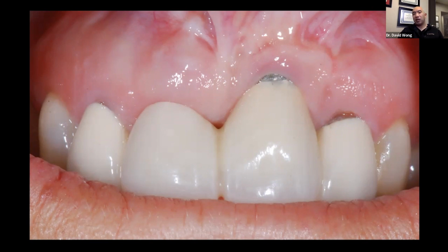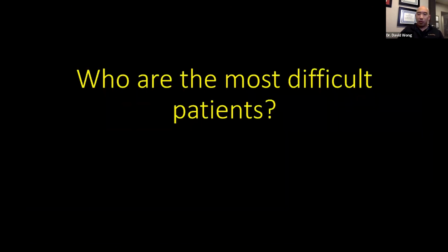I always tell people, it's not like doing a root canal where if you perforate the root, you've got to take the tooth out, or you're done. In a situation like this, if you put your implant in the wrong place and you can't redirect it, you can just choose to leave it out and start over and live to fight another day. So that's one thing about implants. It really tests your ego. Let's put it that way.